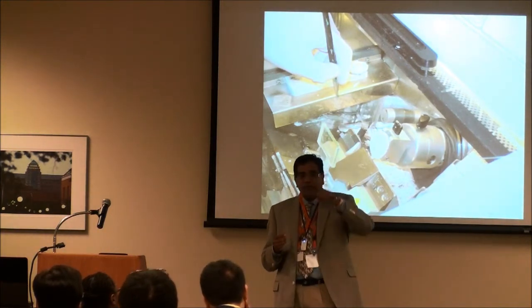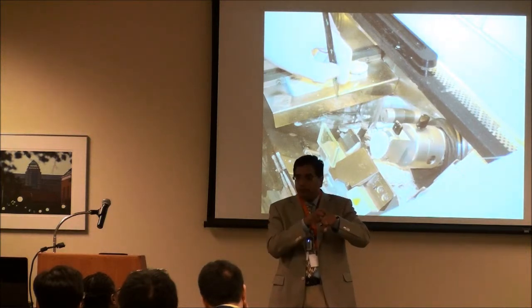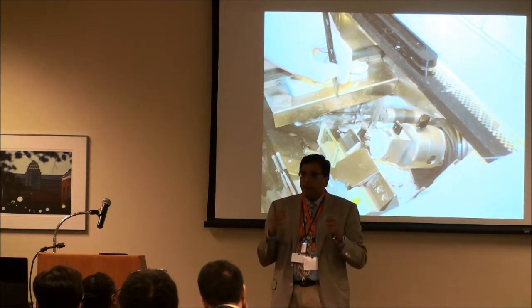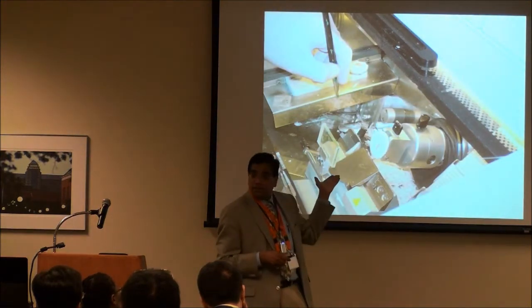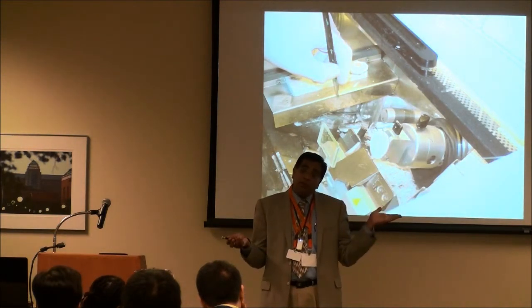With an ultrasound transducer, the sound goes down, the architectural echogenic areas come back, and I construct an image. That image is not as detailed as this H&E, where we can go to 3-4 microns.